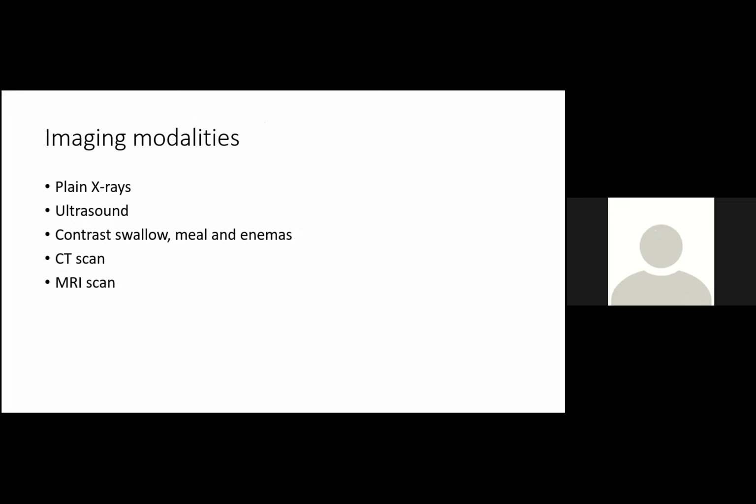Now, I'm increasingly a firm believer in the fact that this is one of the most abused examinations in radiology. What I mean by that is that in a lot of cases, patients are referred for abdominal X-rays, and the information that you can get from abdominal X-rays, you need to be very clear from the outset what it is that you're after, because in some instances, what is reported or what looks like a normal X-ray can be falsely misleading, and in some instances can lead to unnecessary and potentially unsafe delays in getting to the diagnosis.